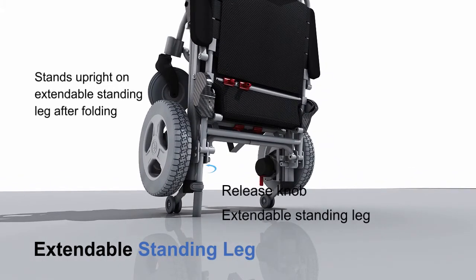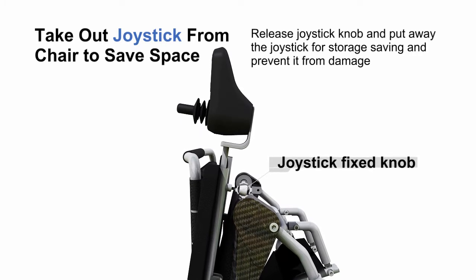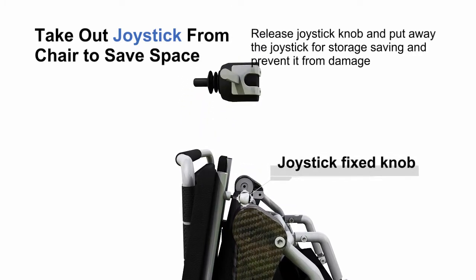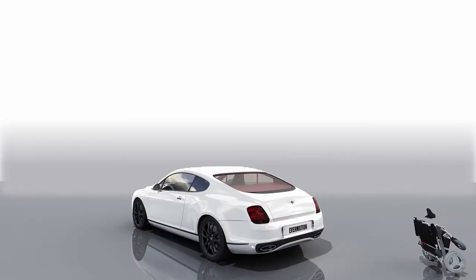Extendable standing legs allow the chair to stand upright after folding. Remove the joystick from the chair to save space — release the joystick knob and put away the joystick for storage, saving space and preventing damage. Portable for travel.